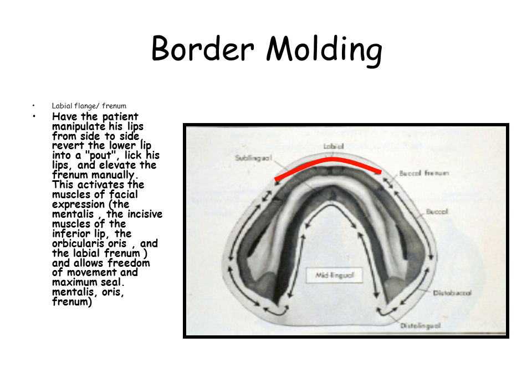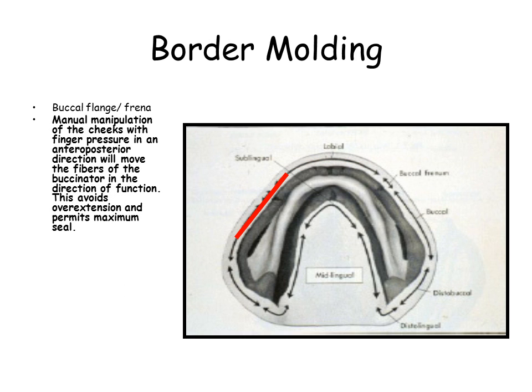The labial flange. Raise and lower the lip. Elevate the frenum manually. The buccal flange area. Massage the cheek. Gently pull the cheek forward and backward.